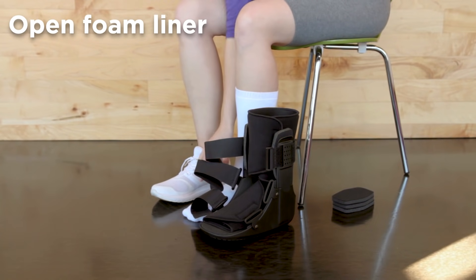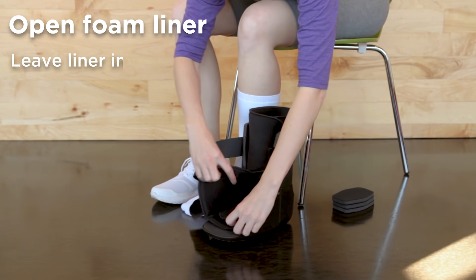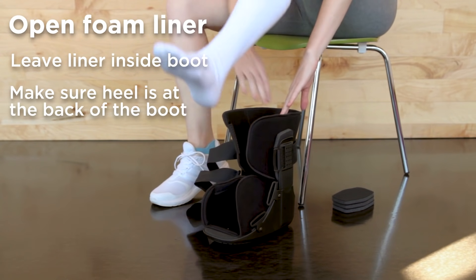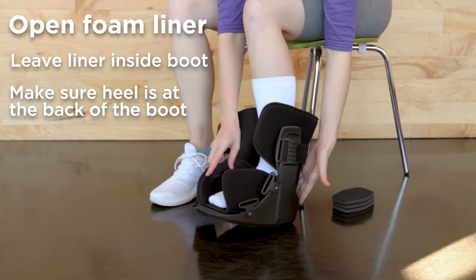Once you have all the velcro straps undone, open up the liner. Some doctors will recommend taking the liner out of the boot, but that isn't necessary. Simply place your foot in the liner, making sure your heel is in the very back of the boot. This is important.